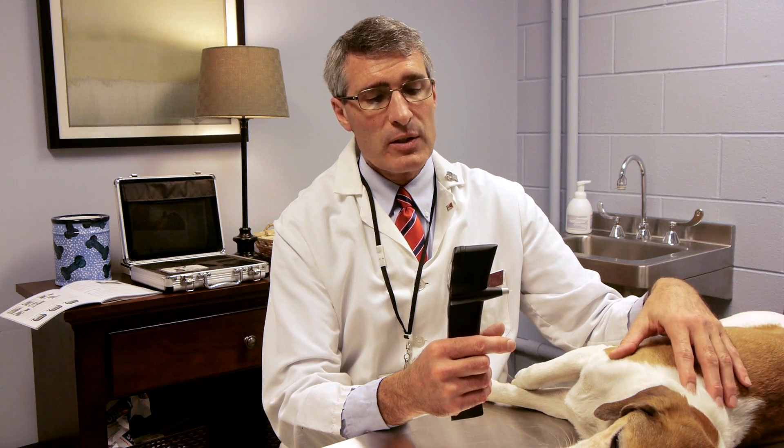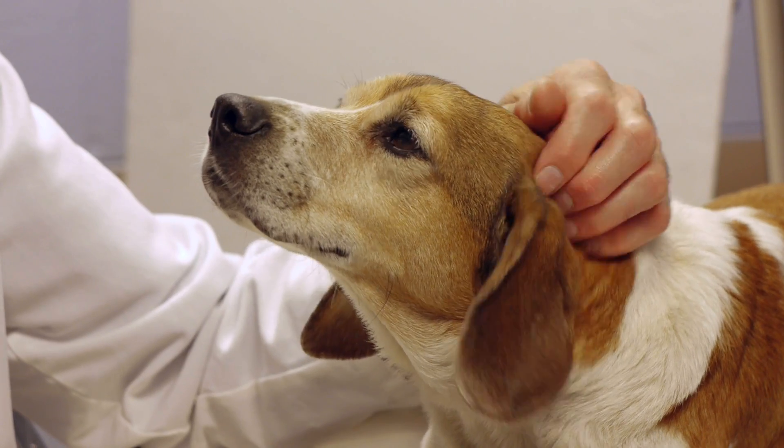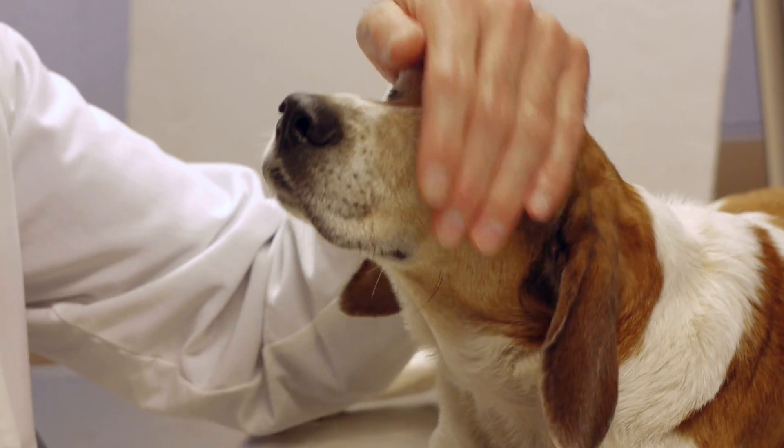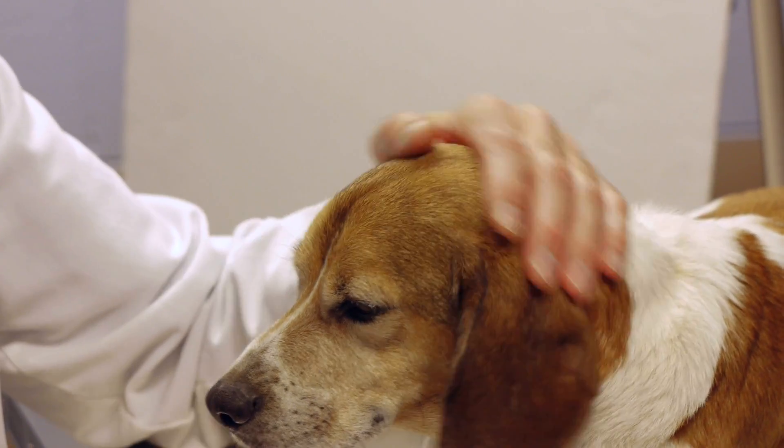This technology is extremely well received, not only by the patient, but also by clients. The pet doesn't have eye drops. The pet doesn't show any signs of struggling. The client feels comfortable — they don't see the air blast that they're used to at their own ophthalmologist, which is very distressing. This is a very calming, soothing way of checking pressures on a patient.